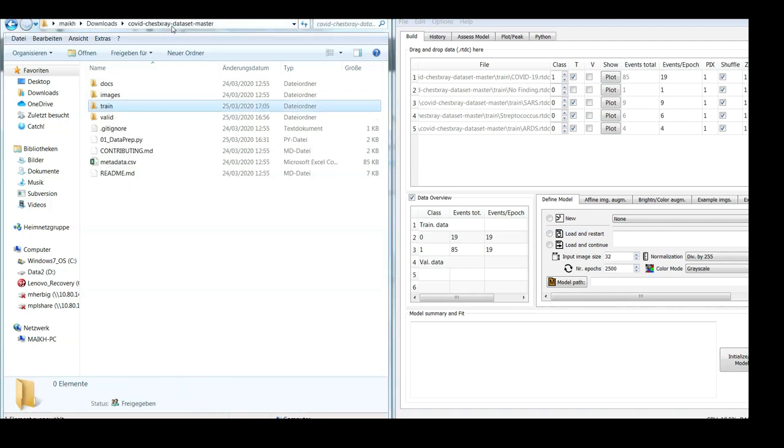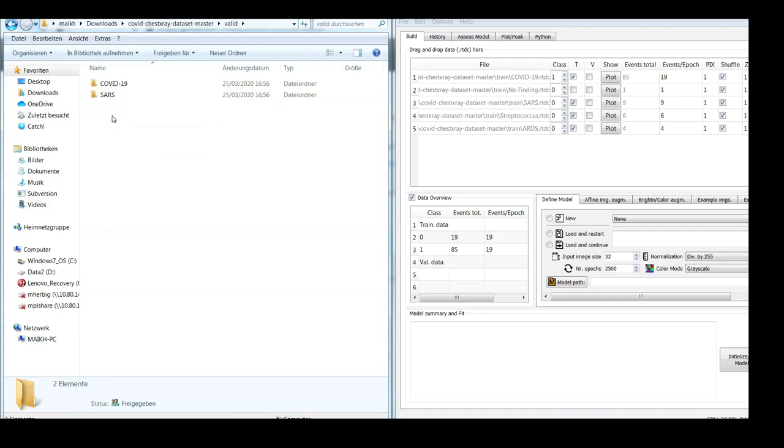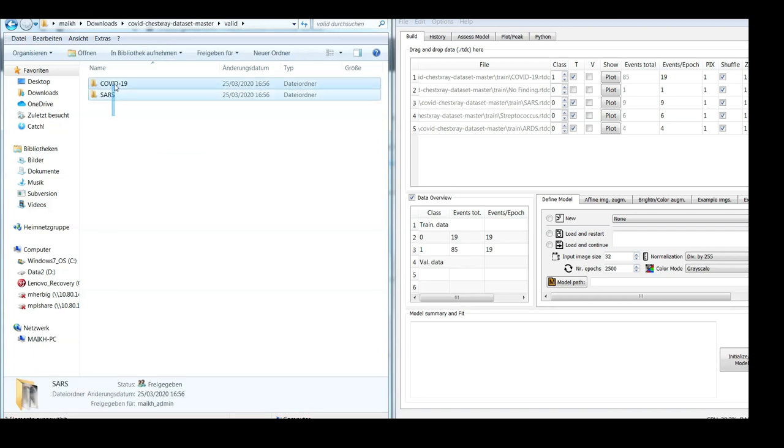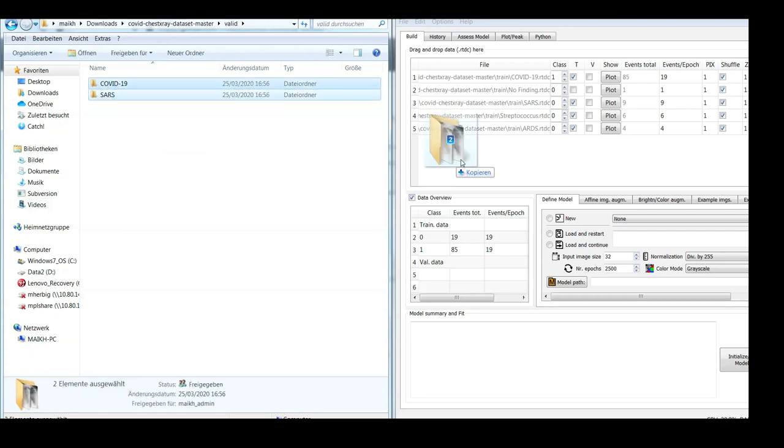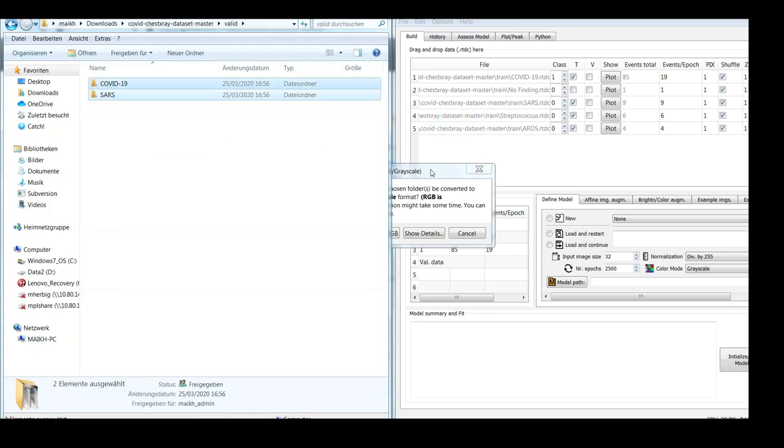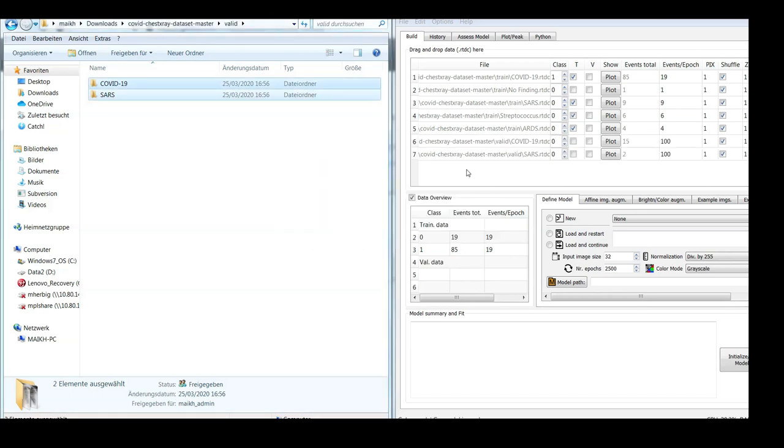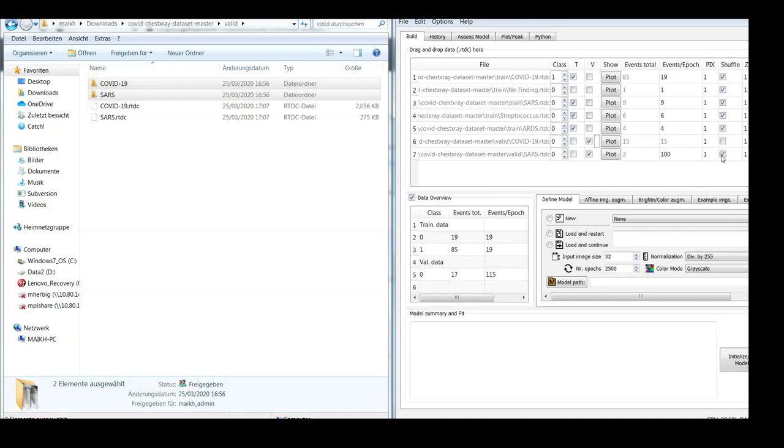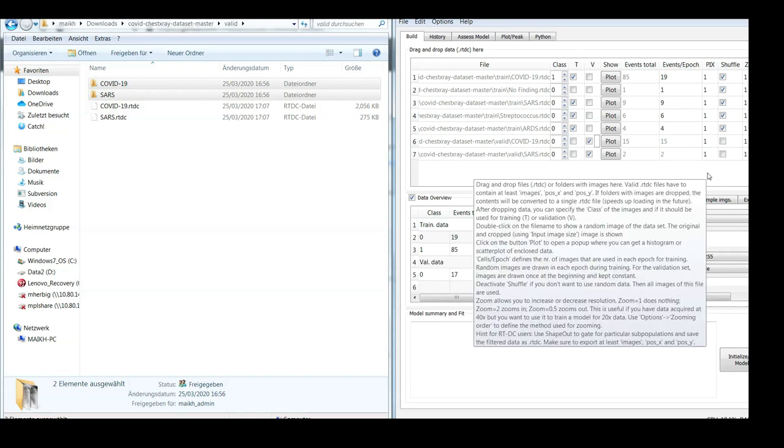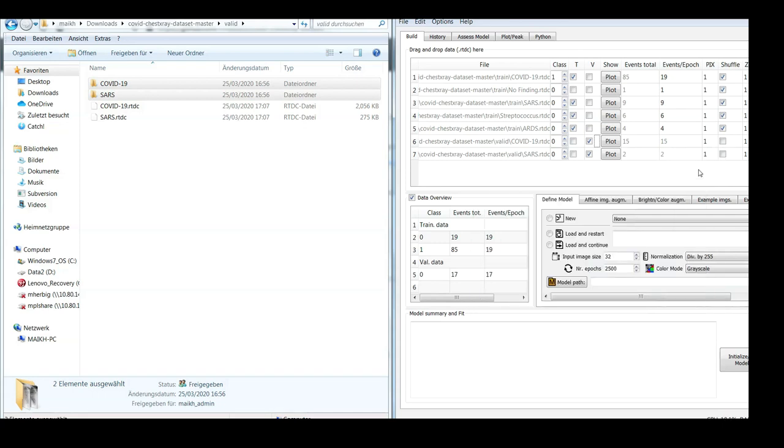Now we only need to load also the validation data, which are only those two folders. So this is validation, and we don't want to shuffle. Creating this artificial class balance by putting the 19 here is actually very important.